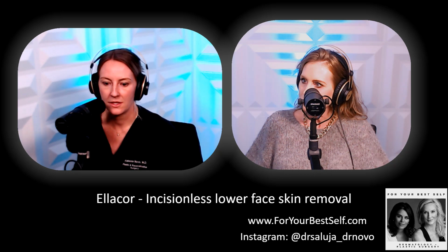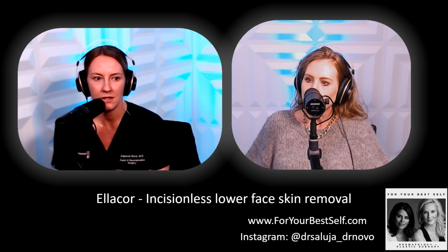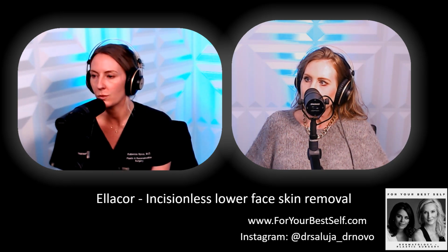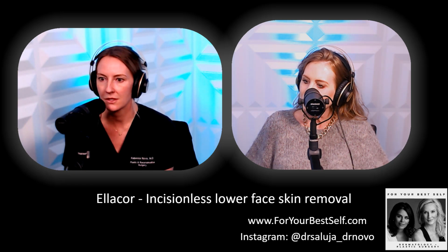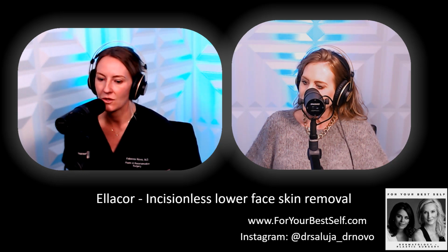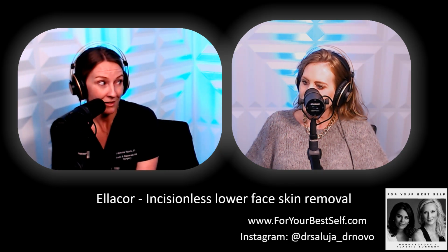I could feel nothing. And then we also use cool compresses throughout to help decrease swelling, and it's also pretty soothing. And we will provide anything a patient feels like they may need for comfort measures, but typically it's been Tylenol. We say avoid ibuprofen, Motrin, the NSAID class, non-steroidal anti-inflammatory drugs, because they do thin the blood and you can get a little bit more bleeding. So usually it's extra strength Tylenol and some cool ice packs, soothing packs. And the post care is relatively simple, gentle cleanser. Nothing special.